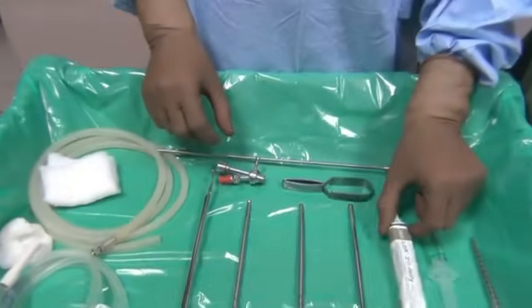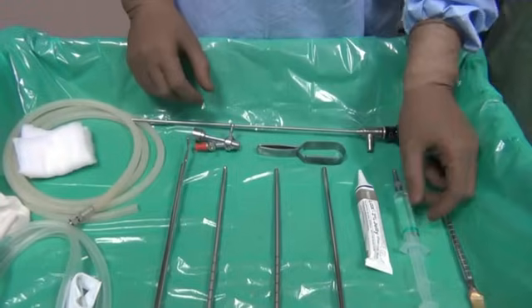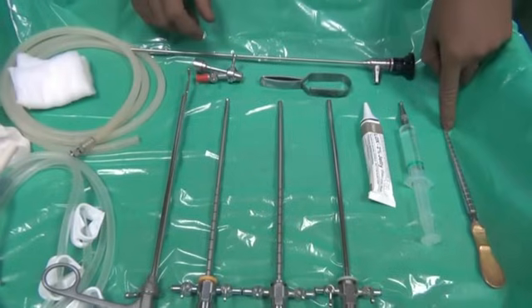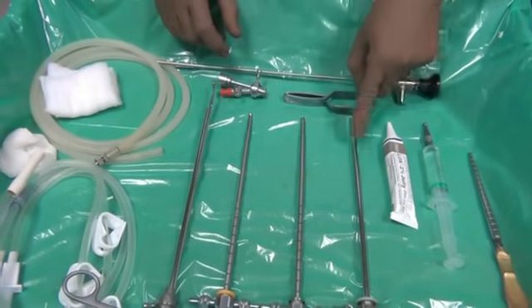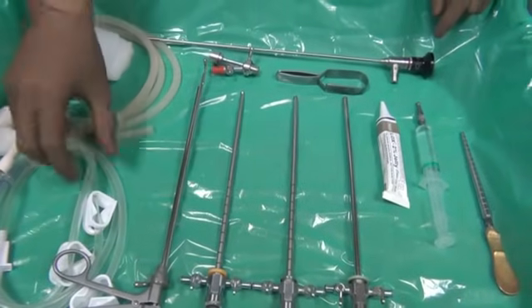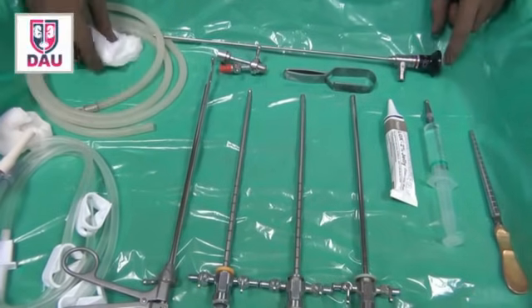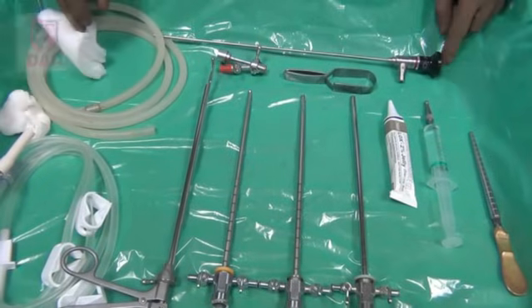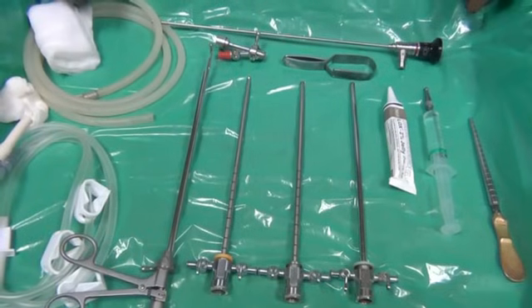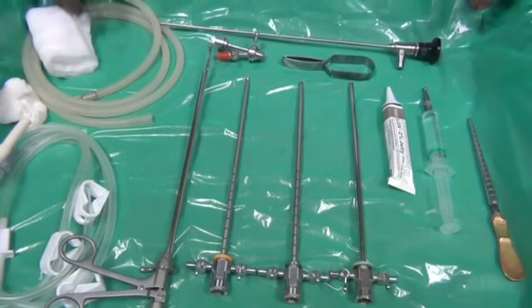You will need Lignocaine jelly for lubrication, and 4% Lignocaine to anesthetize the urethra. You should also have ready a meatus calibrator, as sometimes the meatus is narrow and you need to calibrate it for atraumatic entry of the cystoscope. Then there is the irrigation inflow set and irrigation outflow set. Keep a couple of pads and gauze pieces on the table, and it is also a good idea to have a culture sample bottle, in case you need to collect a urinary culture sample during the procedure.